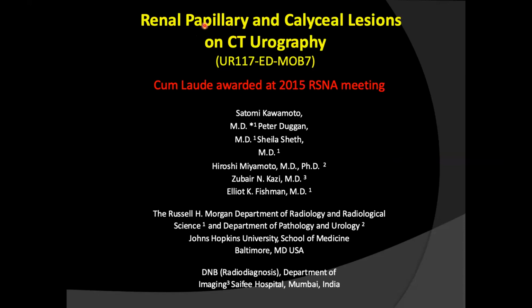Yeah. And Prabhat Kumar is asking extrarenal pelvis versus hydronephrosis. So very easy to differentiate. On any of the modalities, on ultrasound, on CT, or generally on the excretory phase CT scan, if you see dilatation of the pelvis as well as dilatation of the calyces, you know it's hydronephrosis.